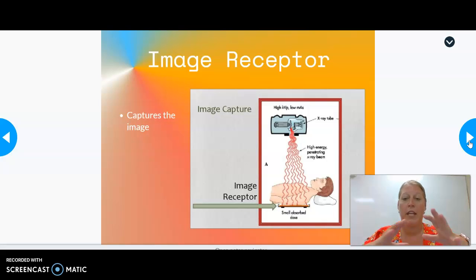So once we went over our tube, and our x-rays are emitted through, again, we have a tube current. The filament heats up. The electrons are all there sitting on the cathode side. Then you produce that button, and it shoots our electrons over to that anode. Okay, so our anode attracts them because it's positive.